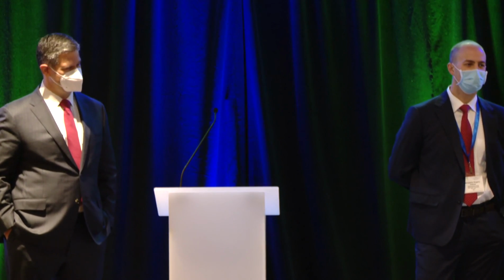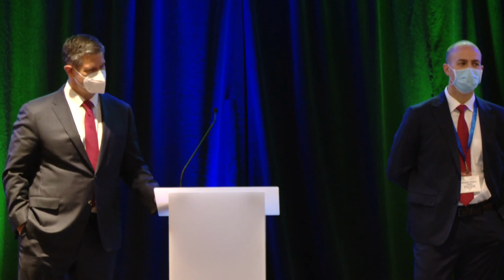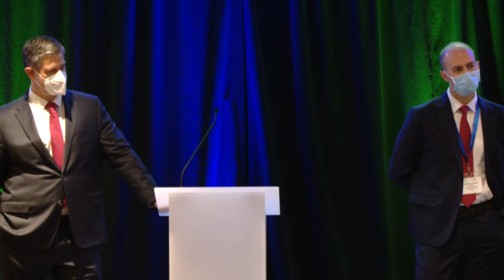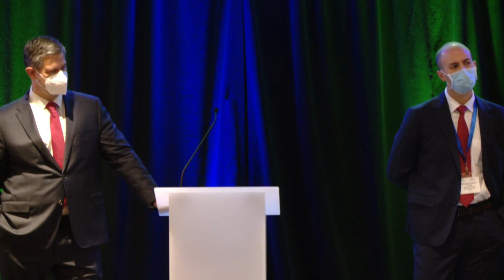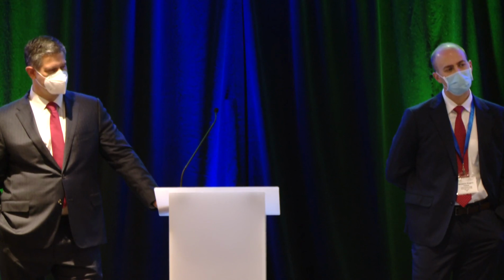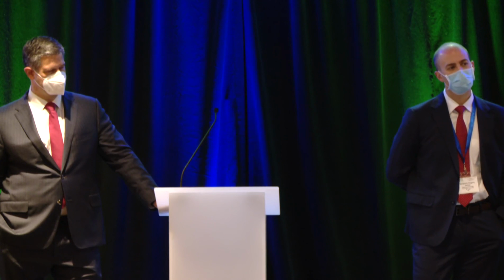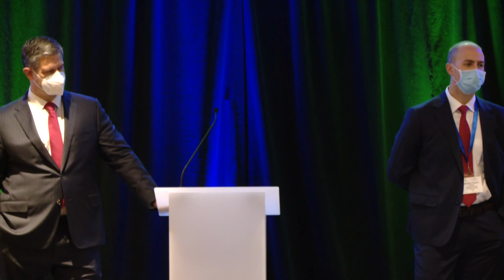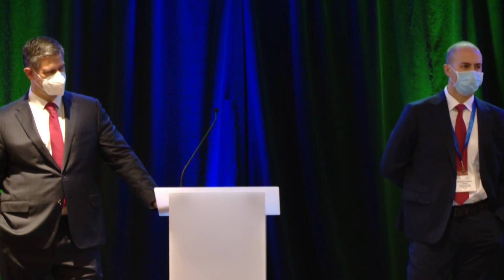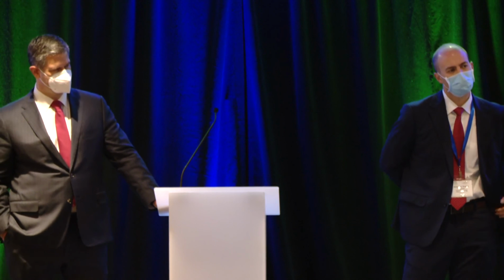So, gastric baseline in somebody with a hiatus hernia: if there is pressurization within the hiatus hernia, then your IRP will be falsely low. But if the hernia is big, then the hiatus is probably open, so the pressure within a large hernia probably reflects gastric pressure. So it's not a problem if you have a lot of space between where the lower esophageal sphincter is and the bottom of the tracing, whether you have traversed the diaphragm or not. It is a problem if the distance is very short. If the catheter has not adequately gone through into the stomach, you don't have two or three sensors.